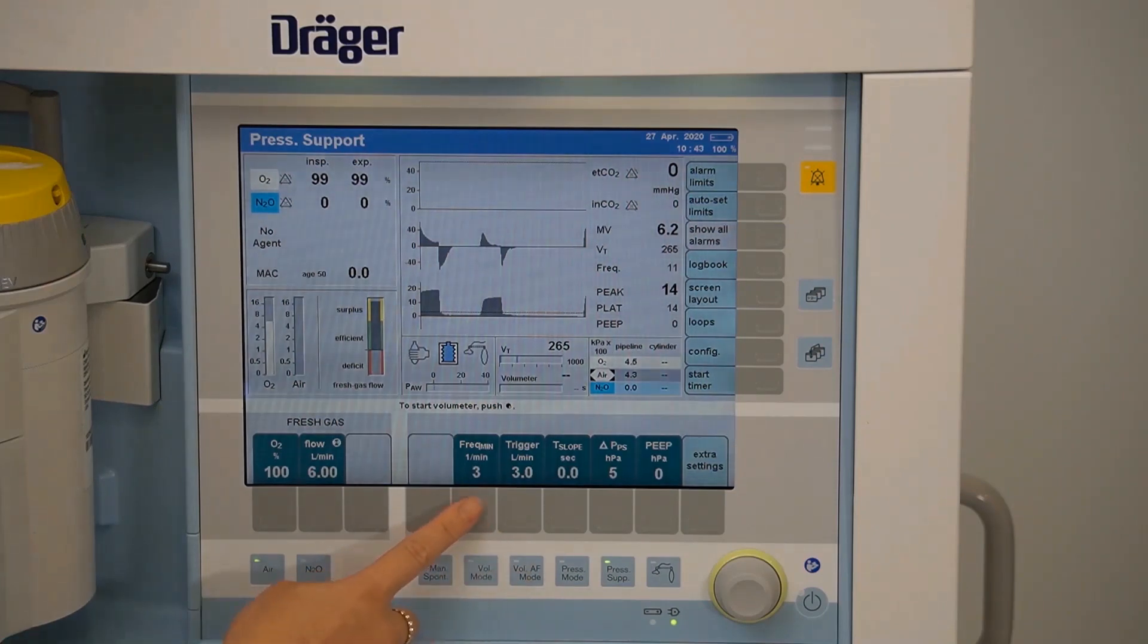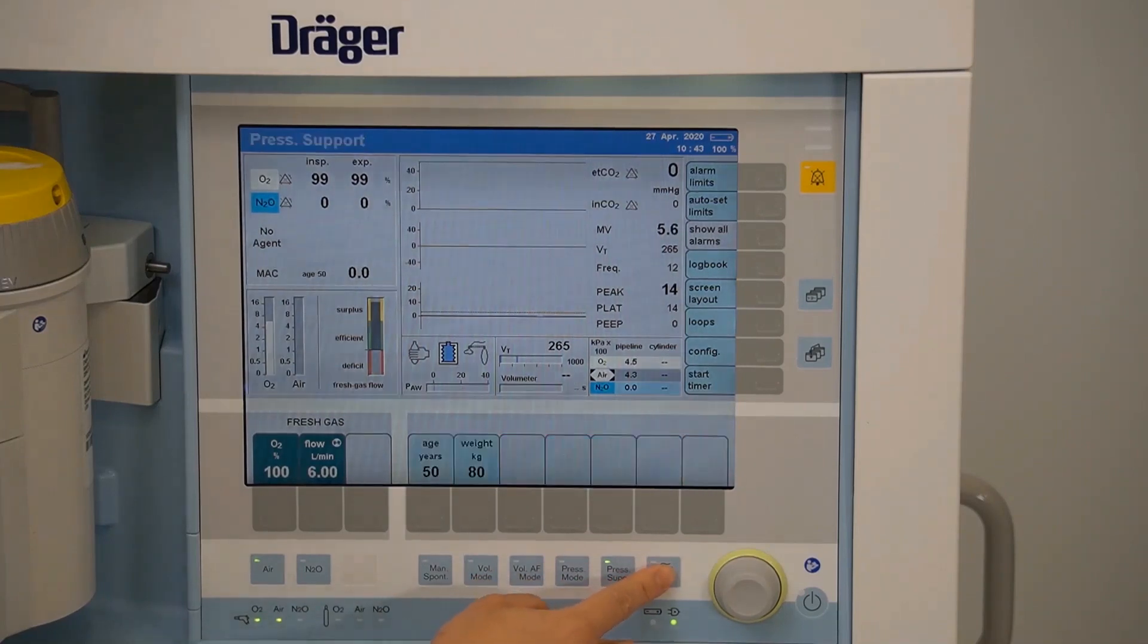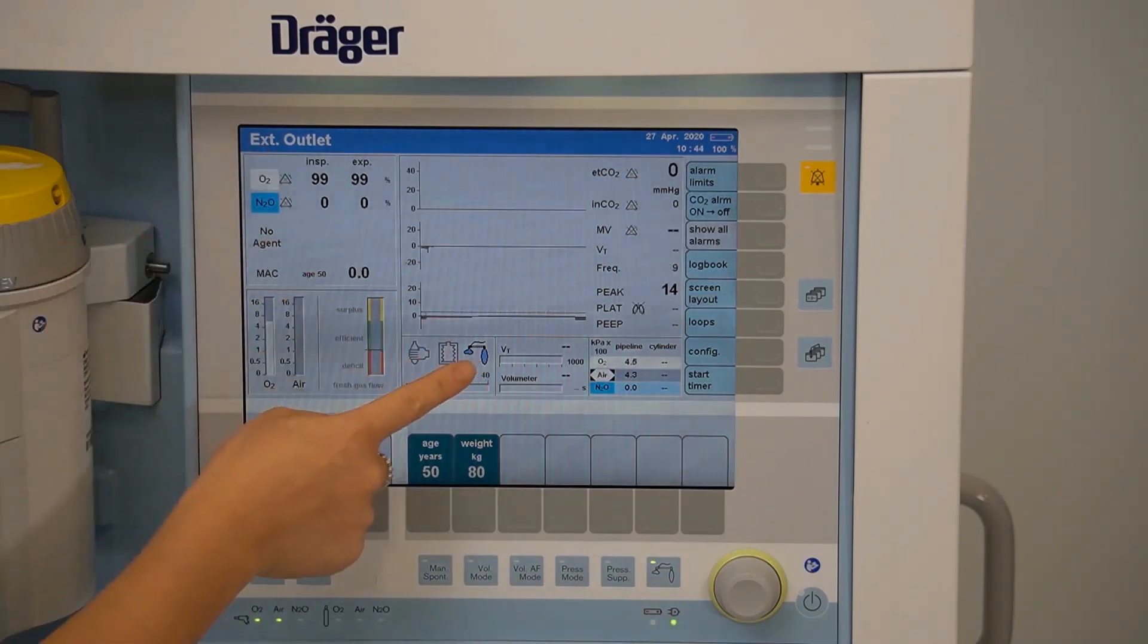Apnea ventilation can also be set by adjusting your frequency of breaths per minute. To access your external fresh gas outlet for non-rebreather circuits, it's confirmed at the top and by this image as well. Your fresh gas will flow from the side of the machine.